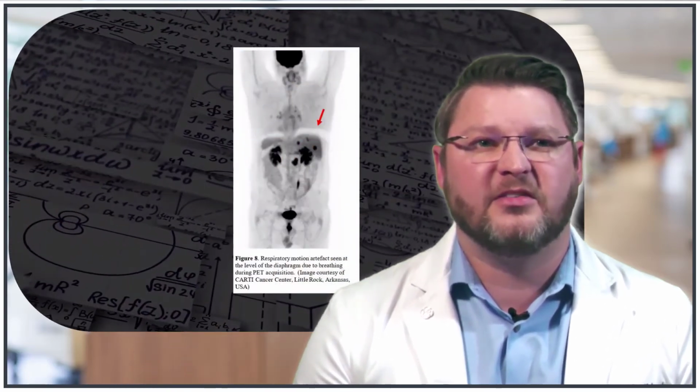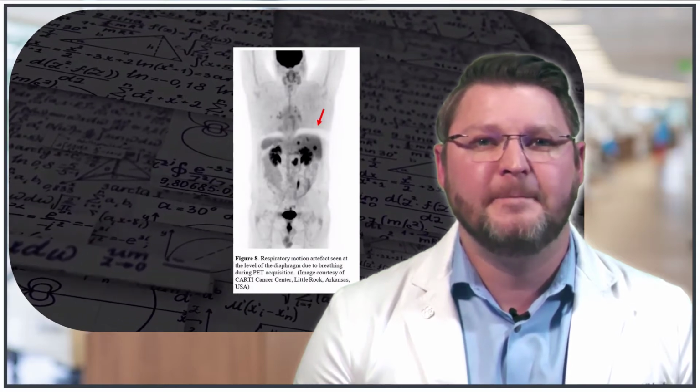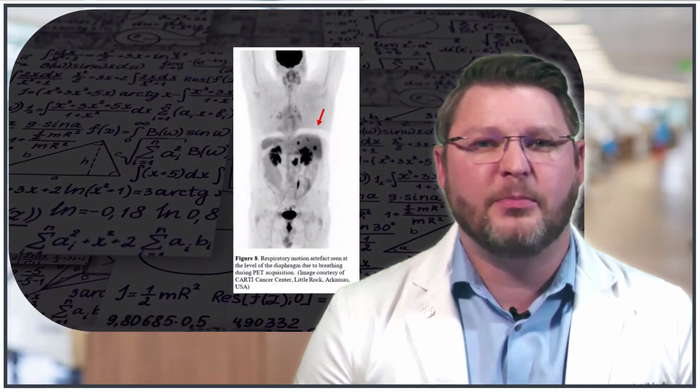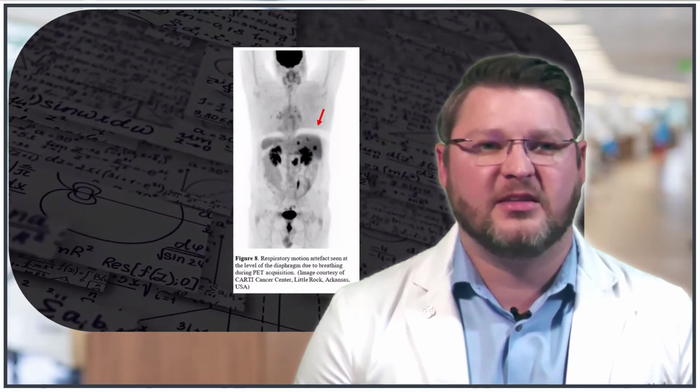Respiratory motion artifact. Respiratory motion is another one of the most frequent artifacts seen in PET-CT imaging. Due to the long acquisition time, the acquired images are representative of several breathing cycles.